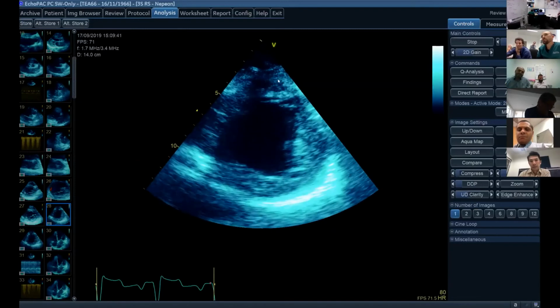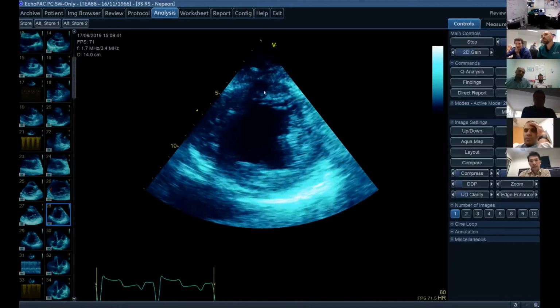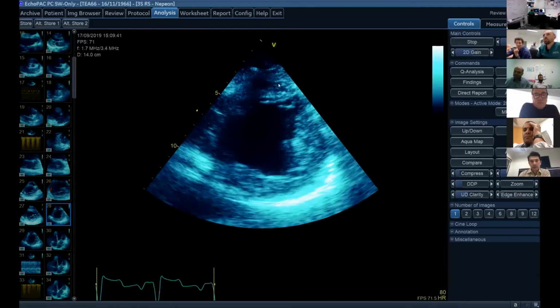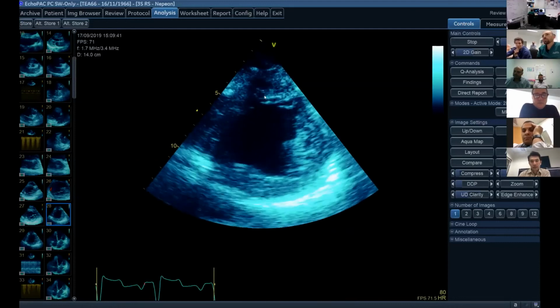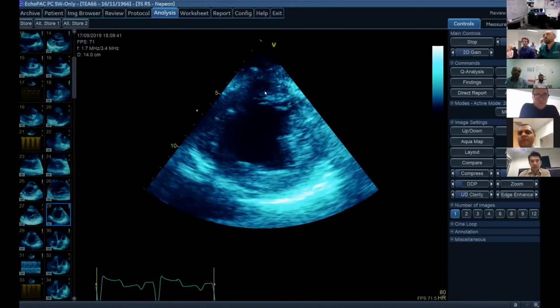Because we're not really seeing it here. See, this looks like normal myocardium. I think it looks the same here where we've got akinesis versus over here. So typically if it's thinned and echogenic or scarred is one of the things. So thinned, echogenic and scarred is chronic changes, as opposed to normal looking myocardium that's not doing a lot, which could suggest acute. It's not perfect, it's just a way.